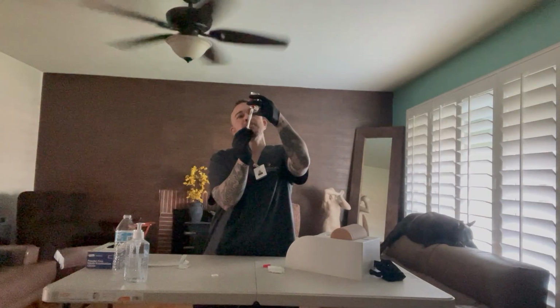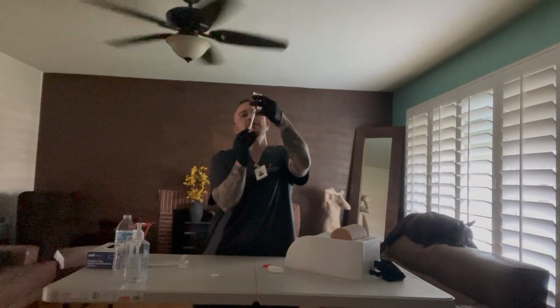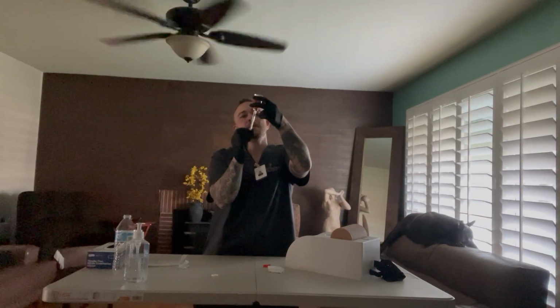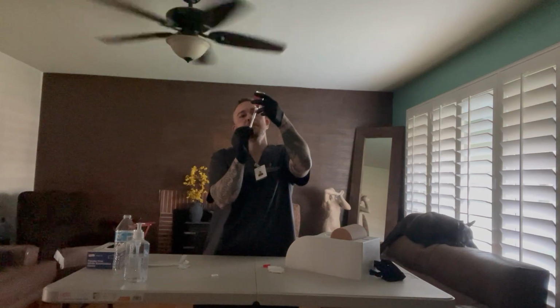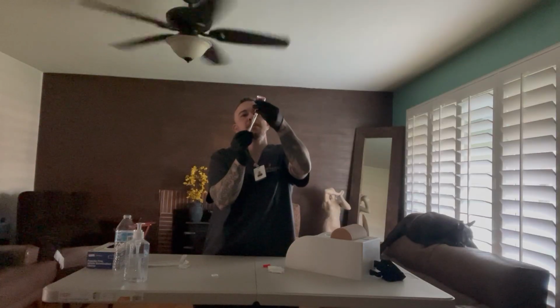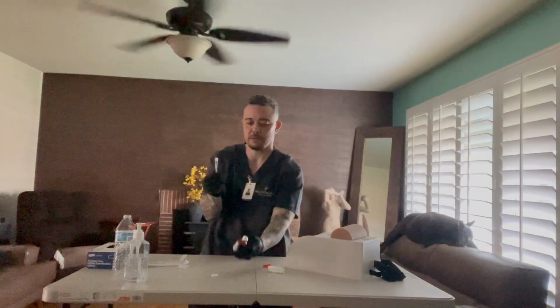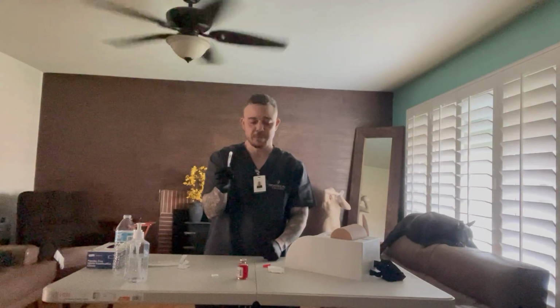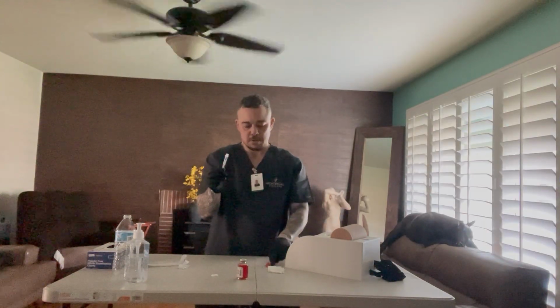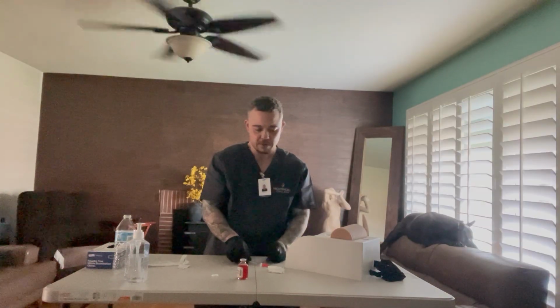I want to make sure that there are no air bubbles in here, and if there are, I'm going to hit the syringe to get rid of the air bubbles. And that checks out. So I'm going to pull this down, put my vial down, then use the swoop technique and cap my needle.